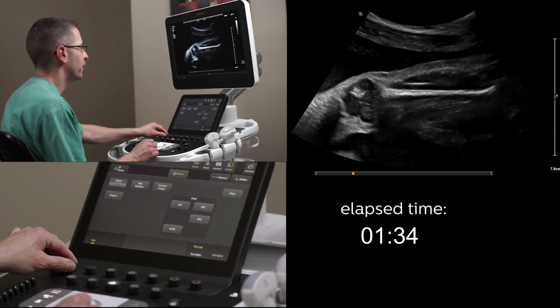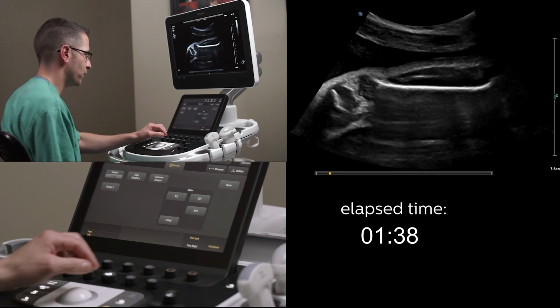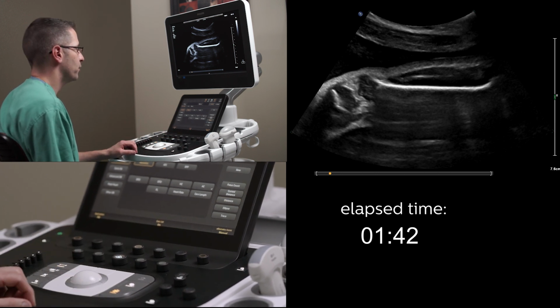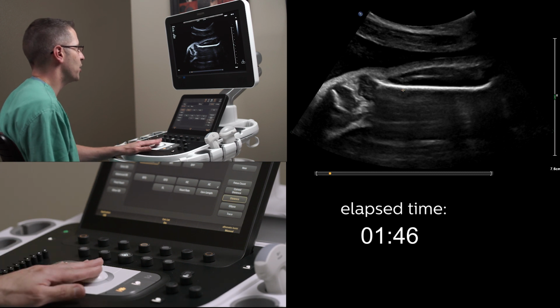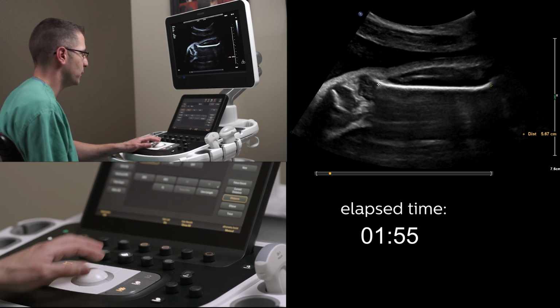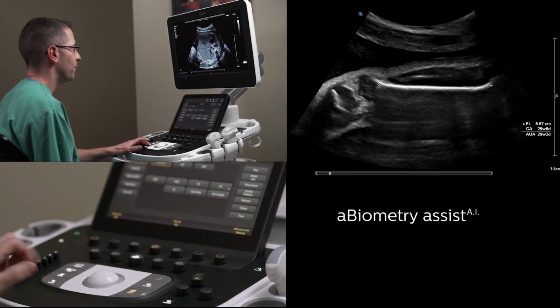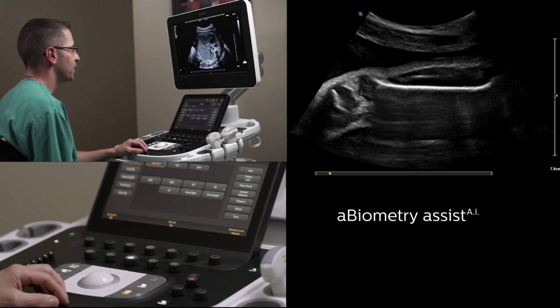Now we're going to go and find our femur. We identify the femur, and let me show you how we're going to measure that manually. So we're going to have our femur, and traditionally we would click measure, come to the lateral epiphyses here, and track over using the trackball again, just taking time to find that correctly, and hit femur length and acquire. I'm going to erase this and show you what this would look like using Biometry Assist.